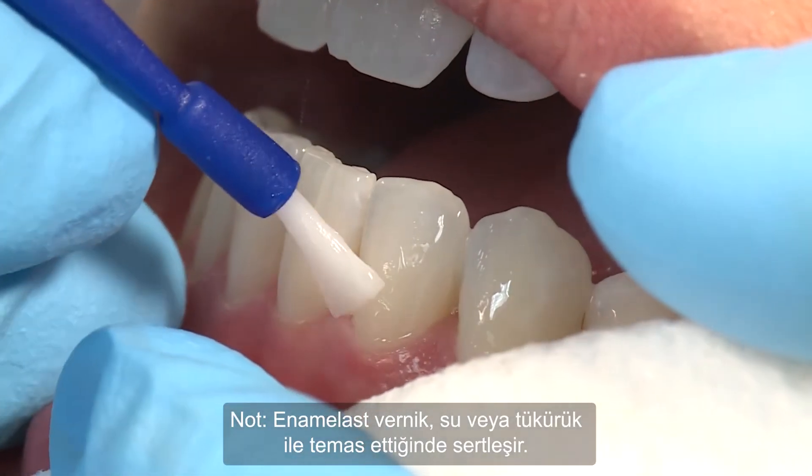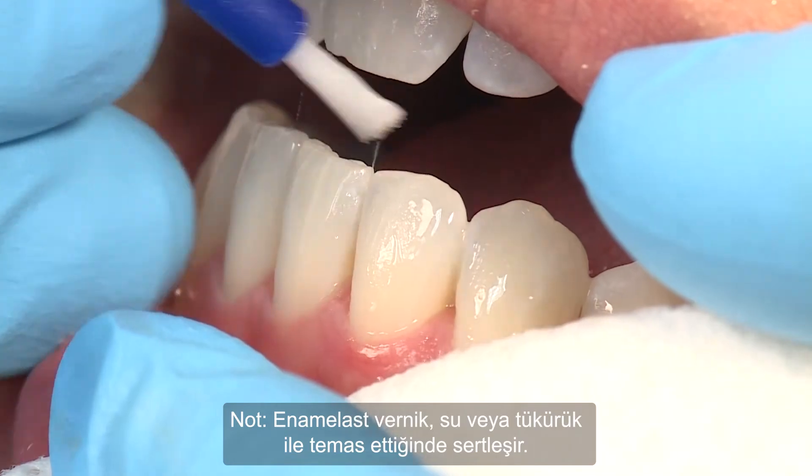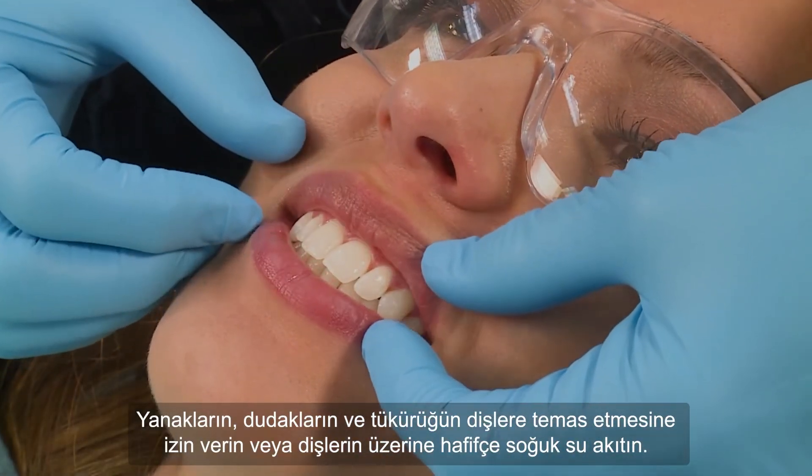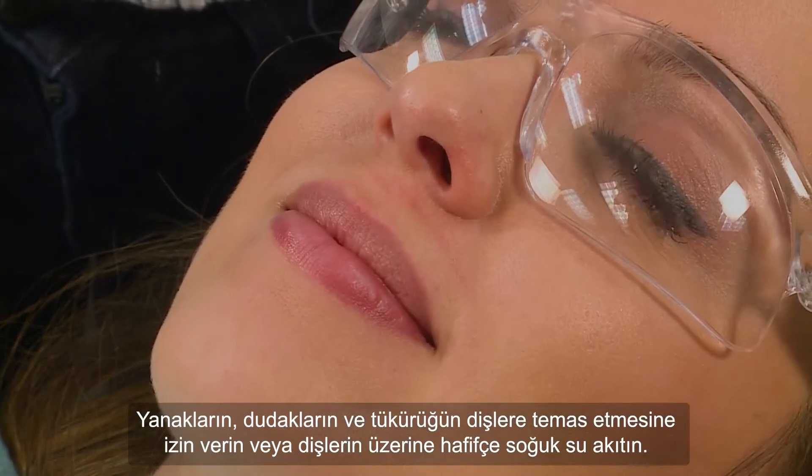Enamel Last Varnish sets when it contacts water or saliva. Allow cheeks, lips, and saliva to contact teeth, or gently flow cool water over the teeth.